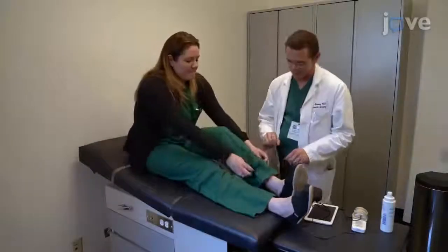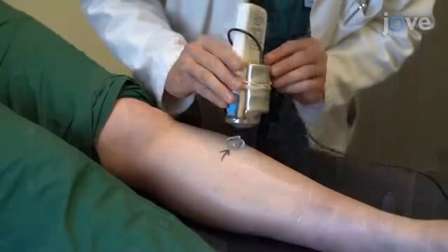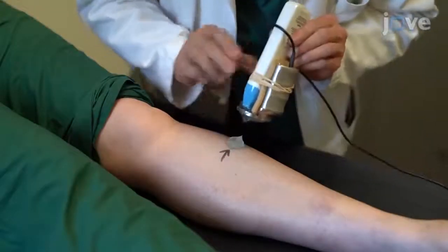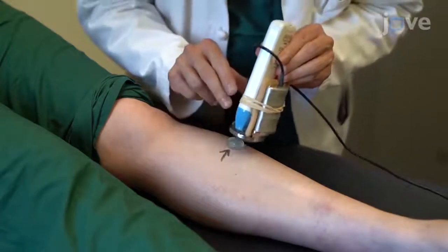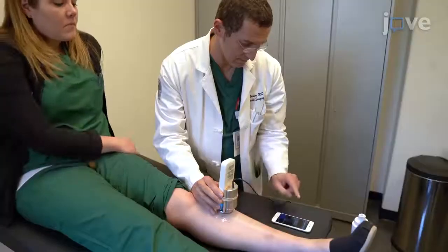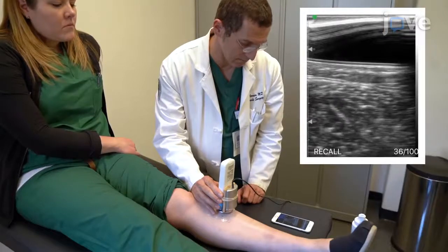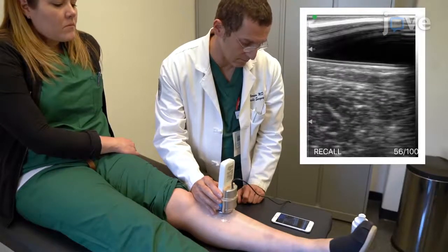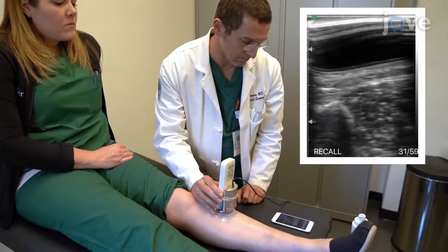To begin this procedure, identify a starting site for the ultrasound probe. Place the probe directly over the anterior compartment, just lateral to the tibial crest, and one hand-breadth distal to the tibial tubercule. Next, identify the fascia, which is the bright white strip just below the subcutaneous tissue on the ultrasound. Move the probe until the fascia is seen at the point where it attaches to the tibial crest.